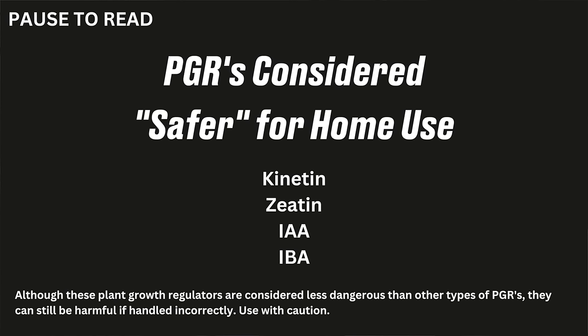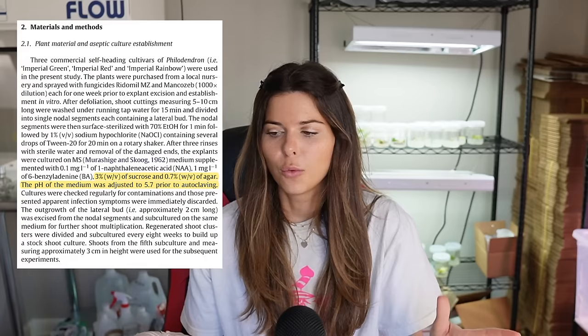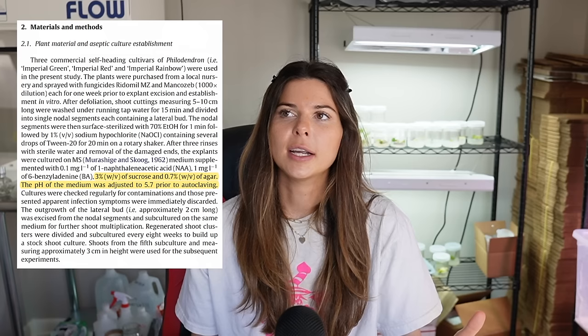Kinetin is considered safer than other plant growth regulators because it is a naturally occurring cytokinin — it's less likely to harm you, your pets, or the environment. Today I'm going to make half a liter of tissue culture media. If you're planning to make a full liter, everything will just need to be multiplied by two. When you read a protocol, the instructions are always in terms of a full liter, so if it says 30 grams of sucrose, you'd divide that by two for half a liter.